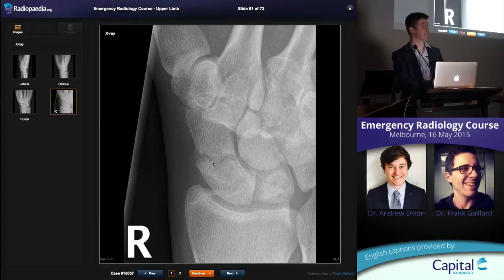You can get a CT straight away, which will probably show you the fracture, but there's a little bit of radiation exposure with doing a CT. But when it's peripheral exposure of radiation, it's a very, very low dose. You can assume there is a fracture and just treat it like that and then get an X-ray in 7 to 10 days and you might see a little bit of sclerosis or the fracture line becomes more obvious.